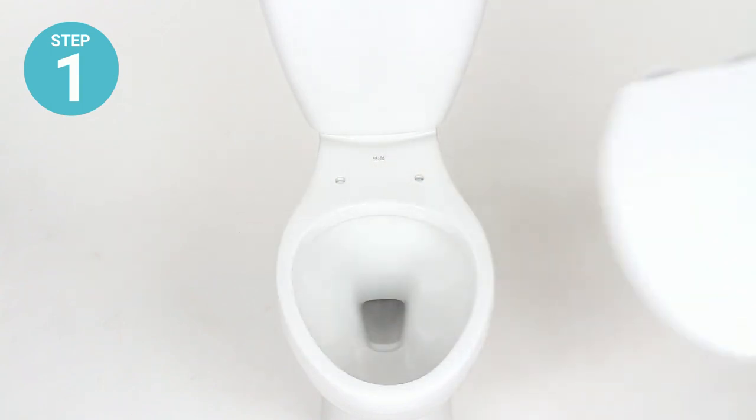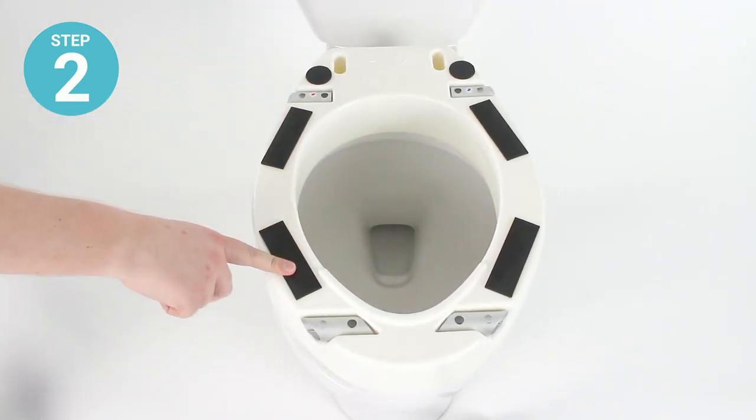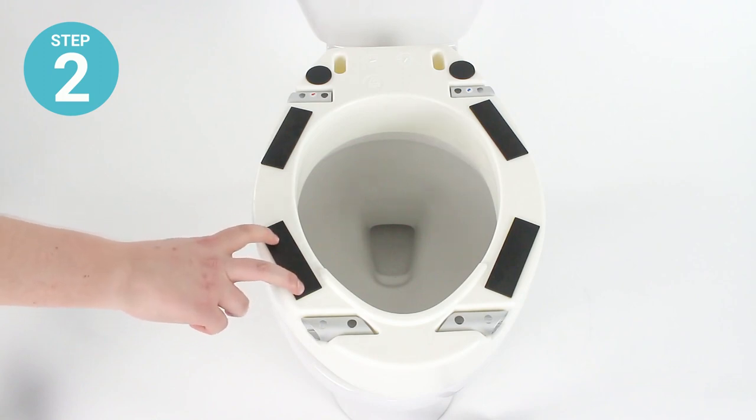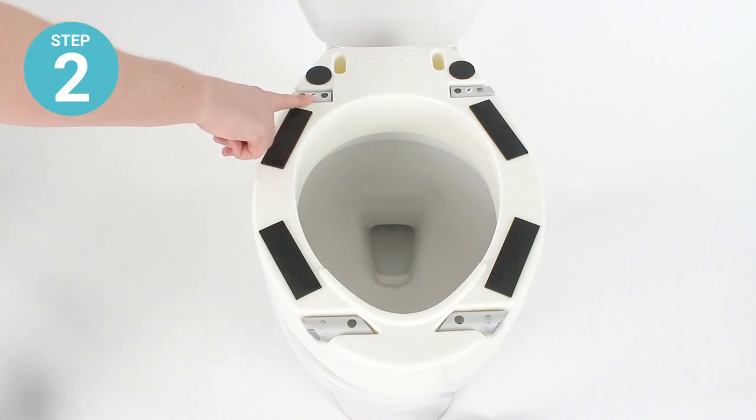Step one: remove the existing toilet seat and lid from your toilet and set them aside. Step two: turn the riser over so that you can see the rubber grip pads as well as the sockets for installing the armrests.